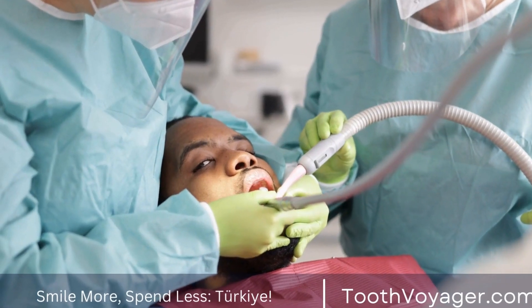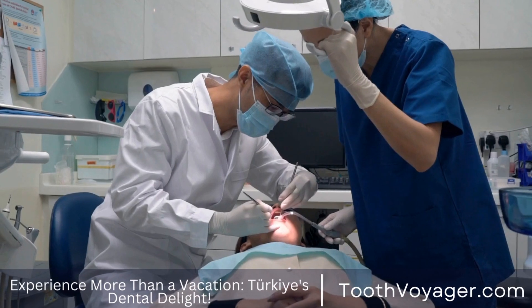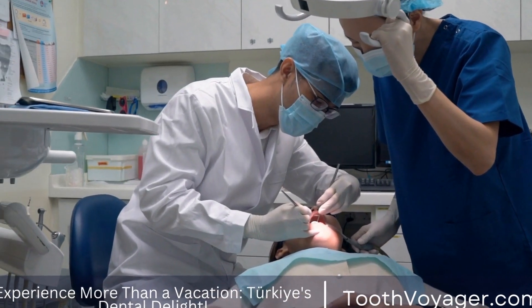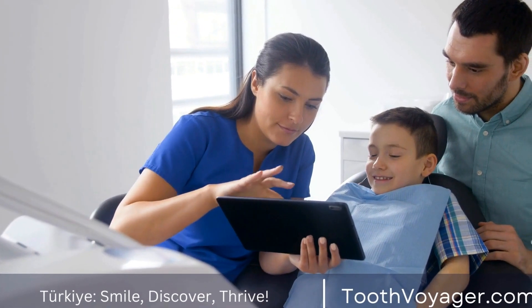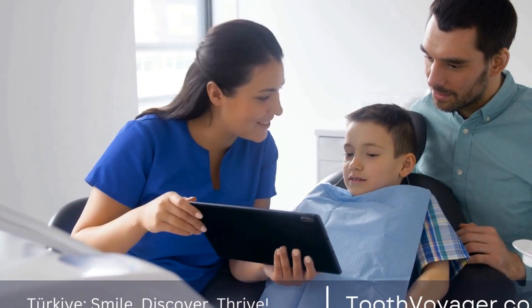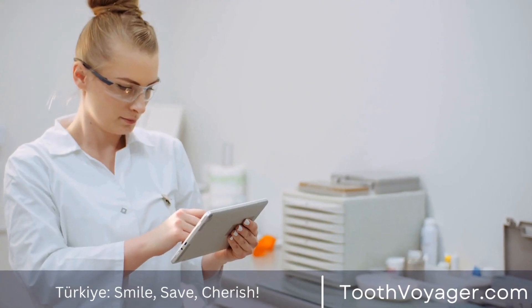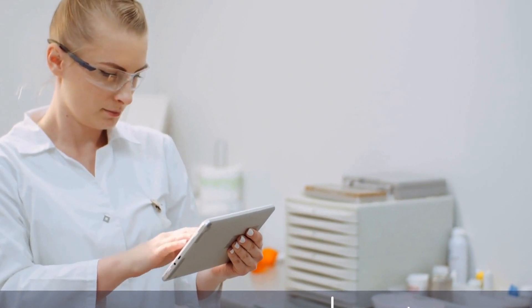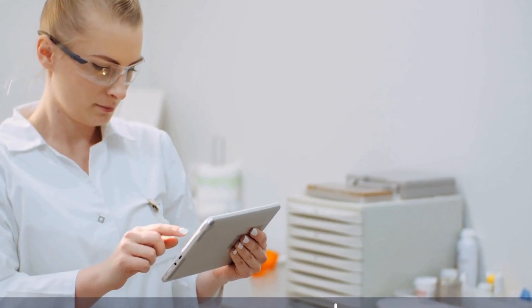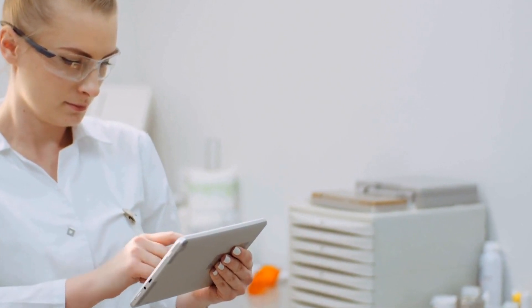Implant dentistry has revolutionized the way we replace missing teeth. Instead of relying on traditional methods such as bridges or dentures, dental implants offer a more permanent and stable solution. But how exactly do dental implants work, and what is the process behind osseointegration and final restoration? In this video, we will explore the steps involved in implant dentistry from initial consultation to final restoration.